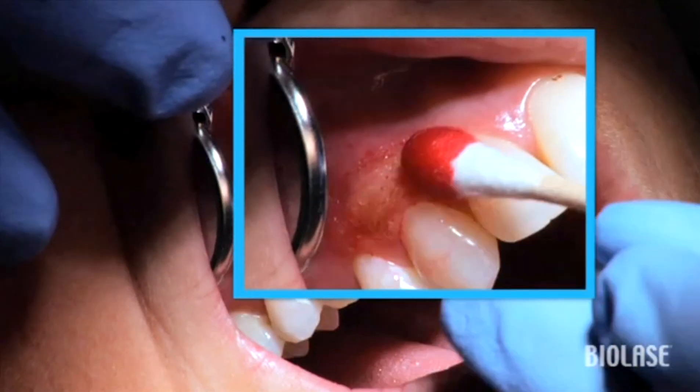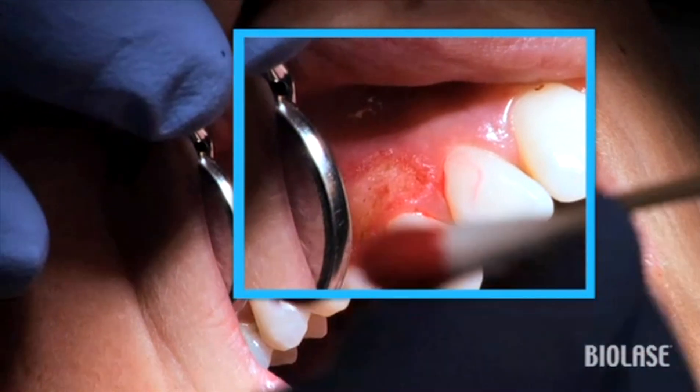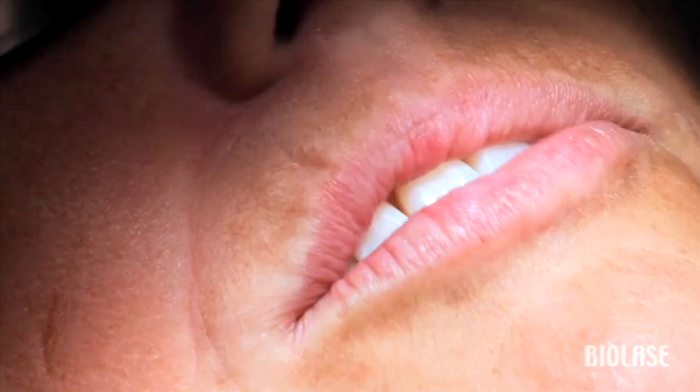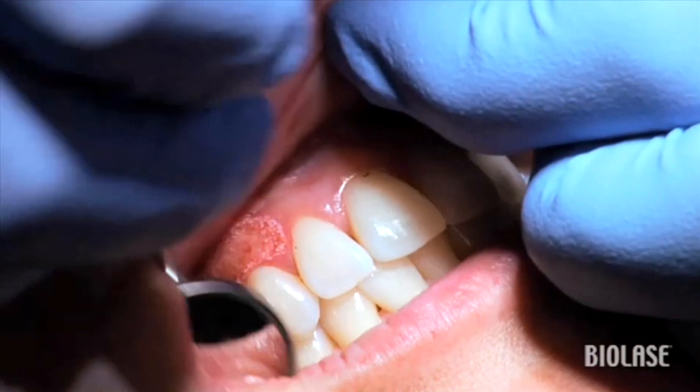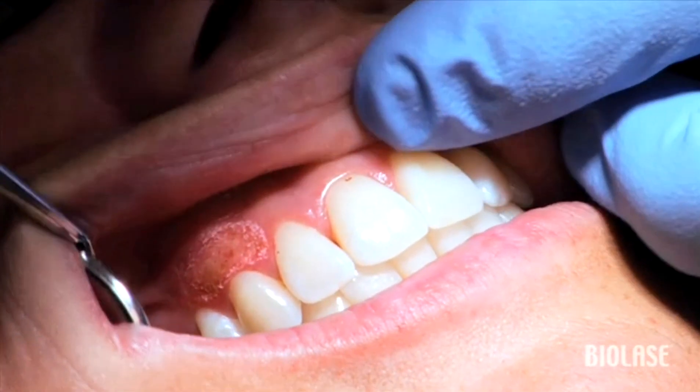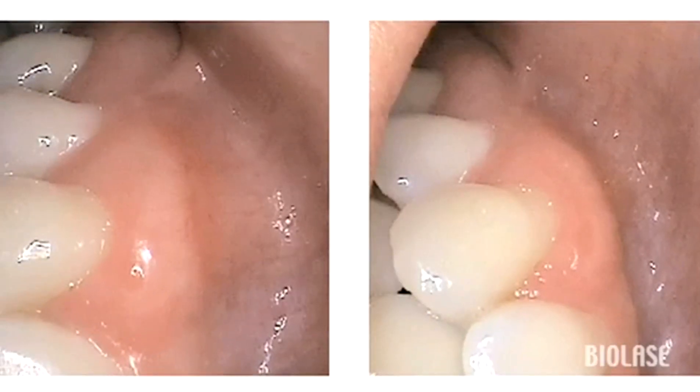The EyeLase removes excess tissue in a very precise and controlled manner. Even if the patient has no post-op bleeding, follow up the removal of the excess tissue with the hemostasis preset for about one minute as presented in the fibroma removal video. The intraoral pics taken one week post-op show beautiful healing. The patient was very happy with the result and was amazed that we can do this so easily and painlessly.